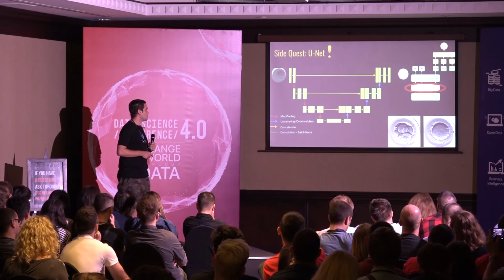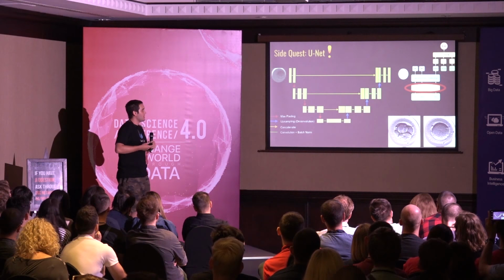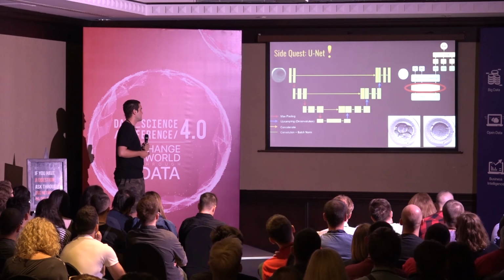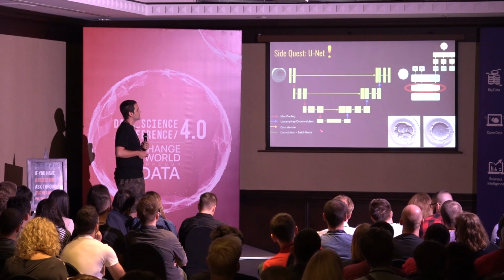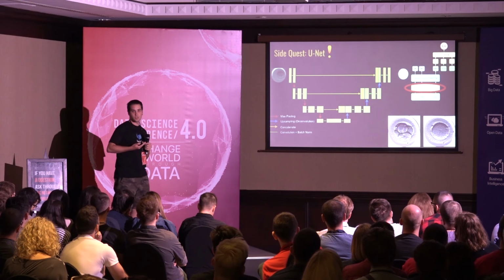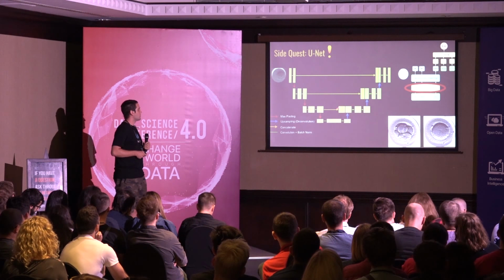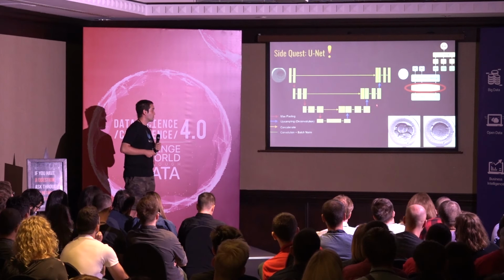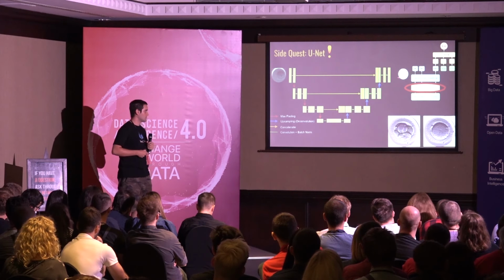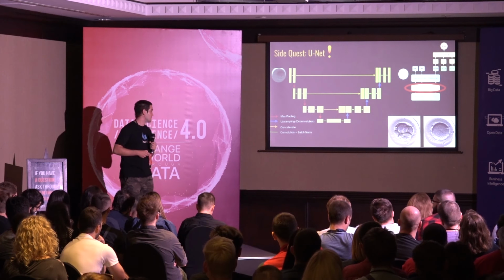After that, from these features, we want to make a same-sized image, but only the binary mask. And the way we're going to do this, we take these features and do some upsampling with convolutional layers. So again, we upsample with the convolution, then do some convolutional layers, and again until we get the same image size, but with this binary mask.